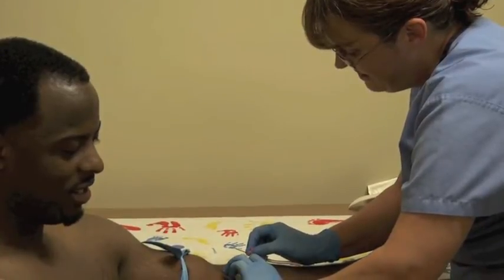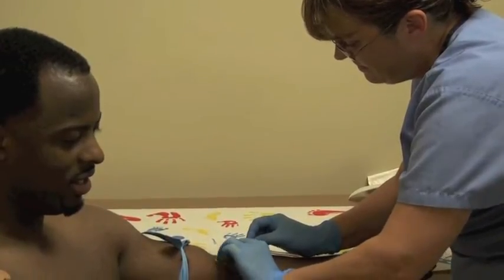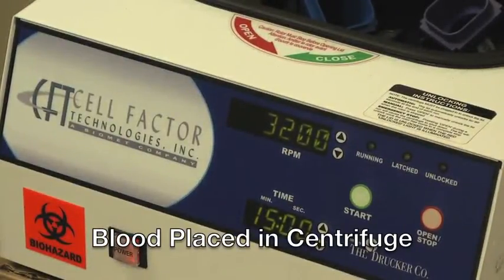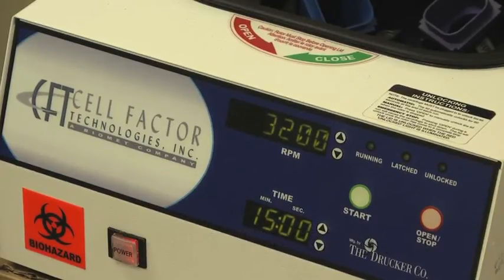First, we'll draw the patient's blood. We'll place the blood into a centrifuge, which we can spin out the different components of the blood to get the PRP isolated.